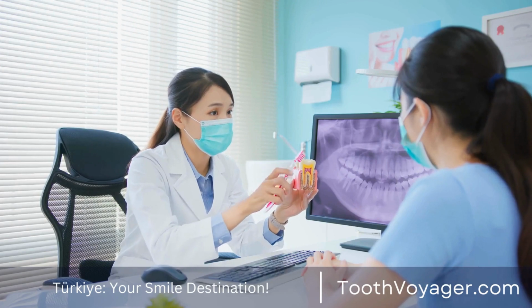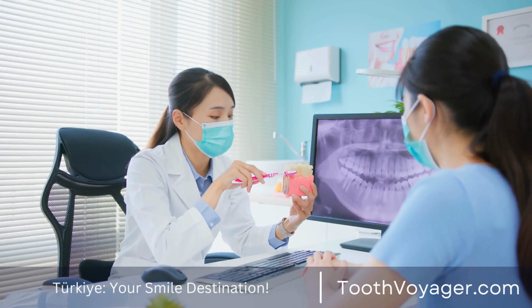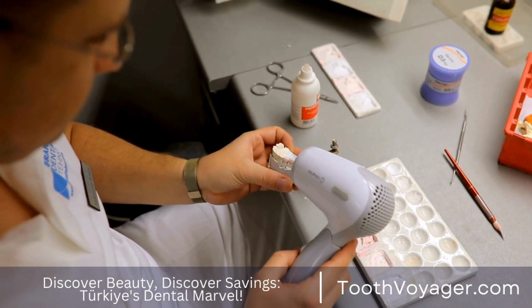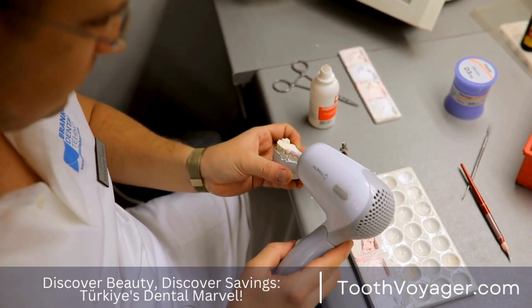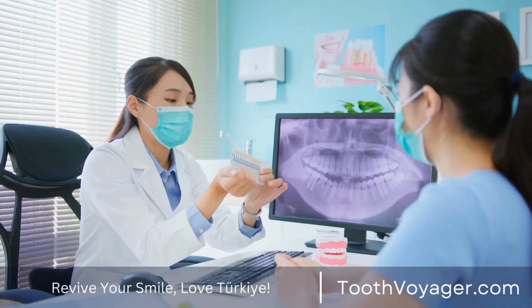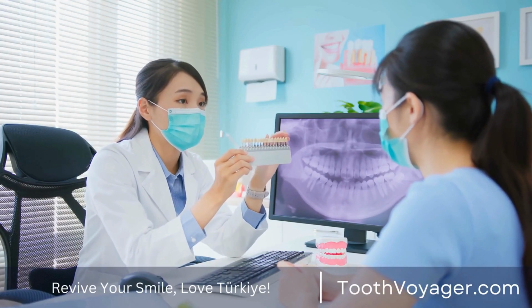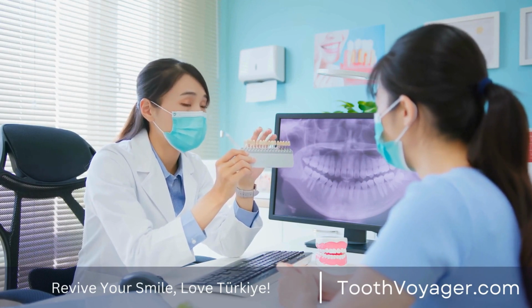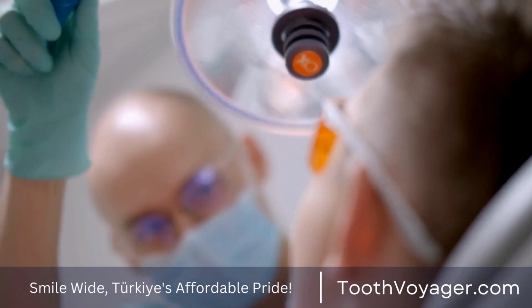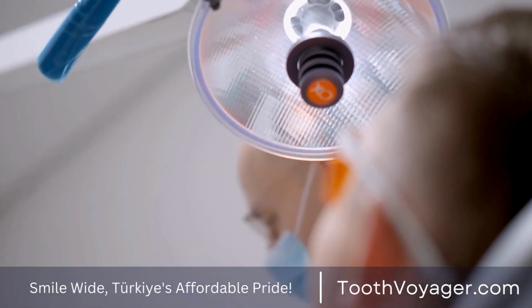Crafting custom dental crowns, the artistry behind functional restorations. With regards to dental restorations, they play vital roles in restoring the form, size, and function of teeth that are damaged or affected. The dental crown is a custom-designed cap placed on damaged teeth to repair the strength and appearance of the tooth. The primary purpose behind dental crowns is providing the necessary restorations.